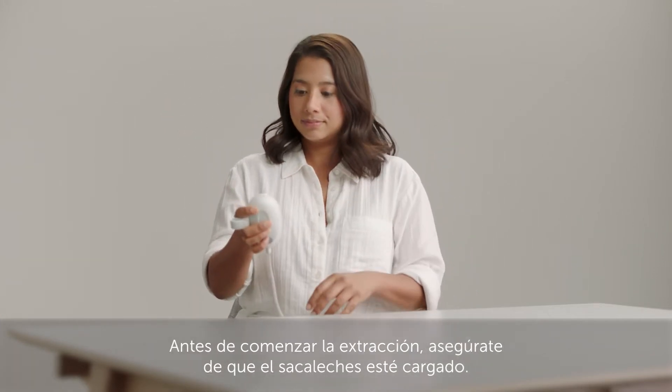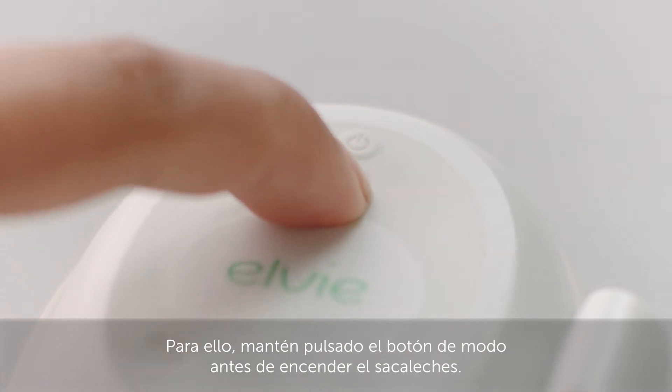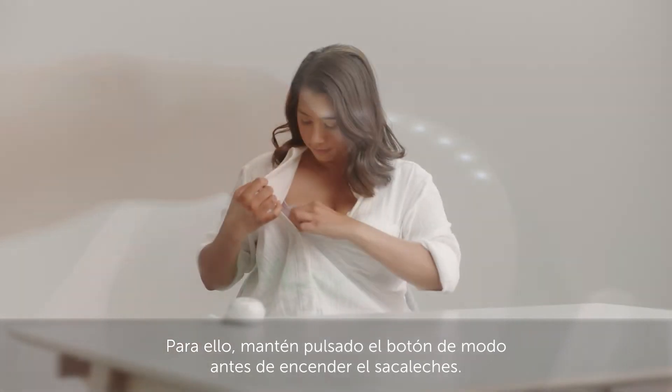Before you start to express, make sure your pump is charged. You do this by pressing and holding the mode button before you turn your pump on.